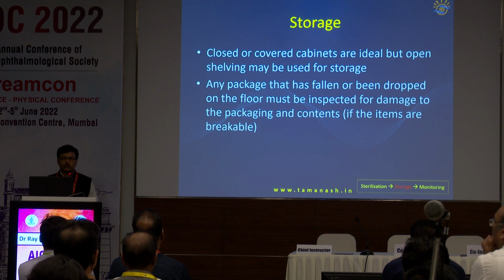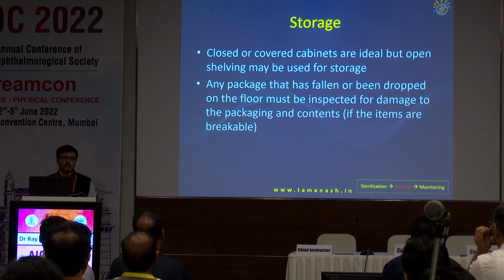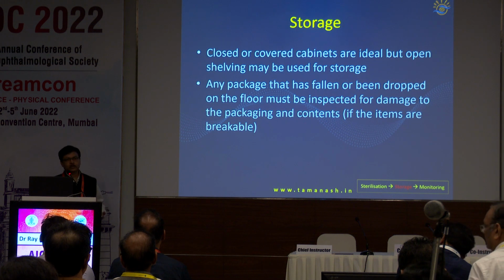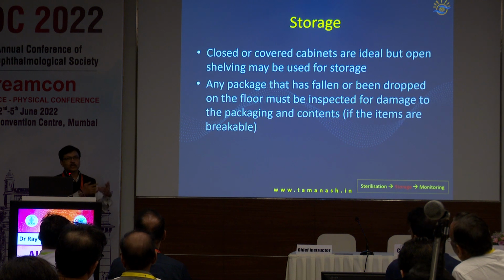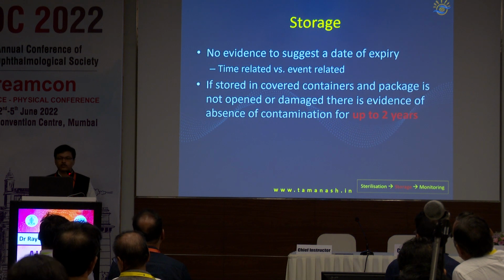If it has fallen to the floor, there is a question: it just fell from my hand, so is it contaminated? Ideally in an OT setup, anything below the waist is considered to be contaminated. So even the undersurface of the table, and that is why you will see we advise our assistants not to hold the trolley railings. That's bad practice. So the rule of thumb is anything below your waist is unsterile, and if it has fallen and you are picking it up and opening it, the chances are that the contaminant from the floor will stick to your hand and you will transmit it somewhere else. So it is best to re-sterilize if it has fallen to the floor.